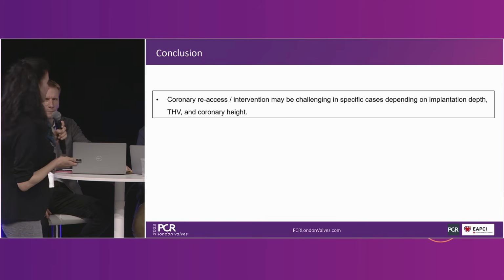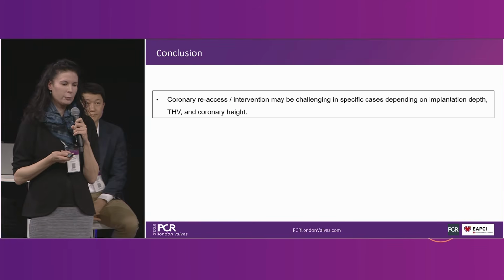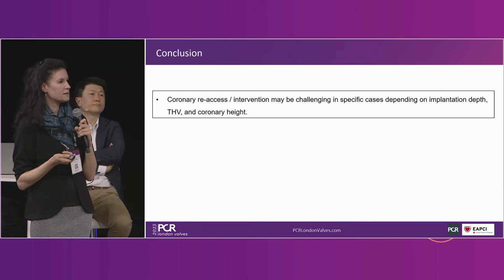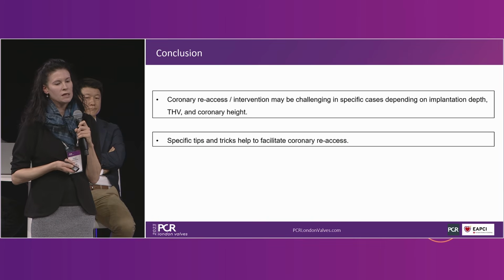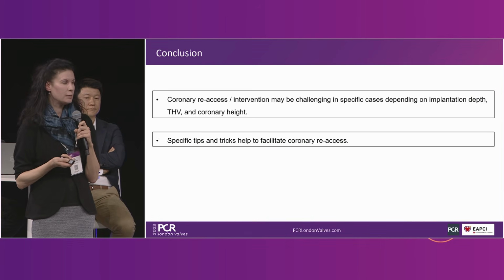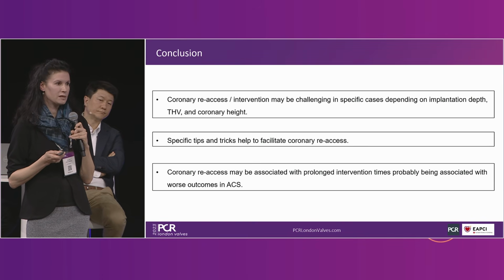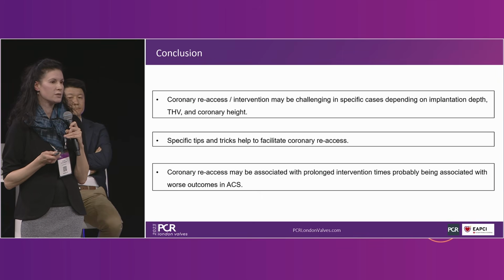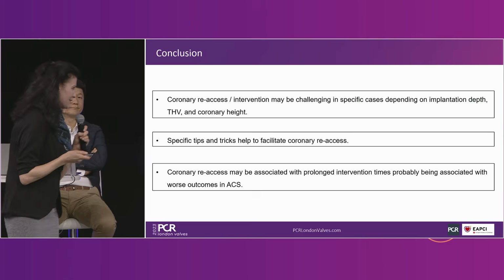So before I hand over to my colleague Francesca, I'd like to conclude the following points. Coronary re-access and intervention may be challenging depending on several risk factors. Specific tips and tricks can help to facilitate coronary re-access. However, prolonged intervention times can also be associated with worse outcomes. So thank you very much for your attention. And Francesca, it's your turn. Thank you very much.